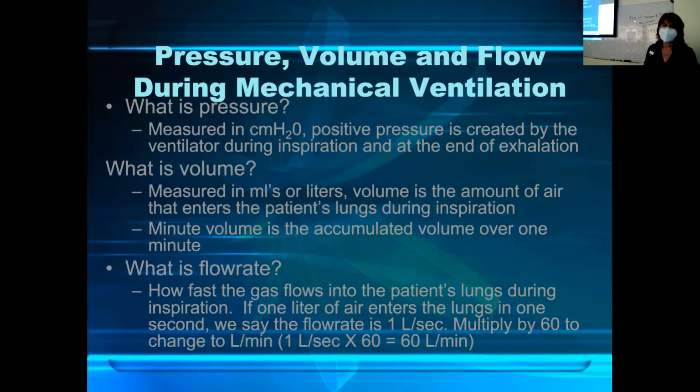Okay, and then on the ventilator, graphics are a big deal. So we're going to spend a lot of time looking at graphics and what you're supposed to take away from looking at the graphics. So here it just starts off by explaining what we're going to measure. We're going to measure pressure.